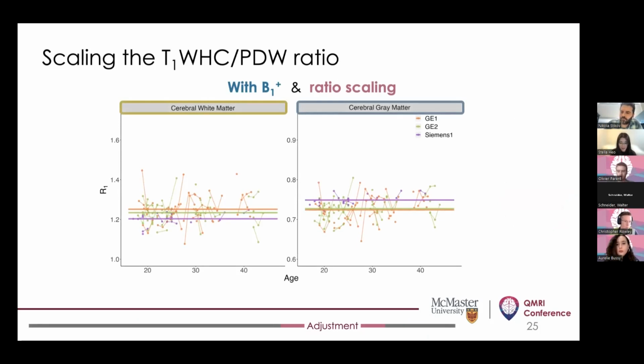But of course, this is qualitative and not of any statistical relevance. But if we do look, we are expecting for gray matter, at least for intracortical myelin, through this age range a slight increase and then a plateau near the end of this age range. And I think at each site, we can see the plots moving up and then scaling down in terms of the increase. Though, again, I think we would have to conduct proper statistical analysis to see if that really is the case. Thank you.